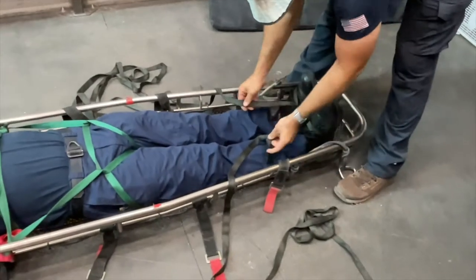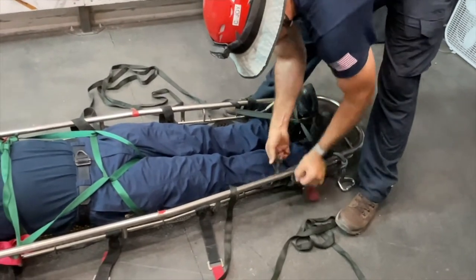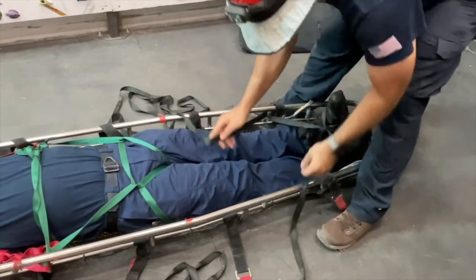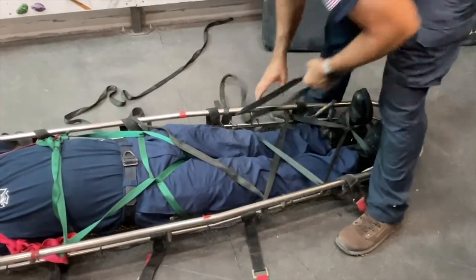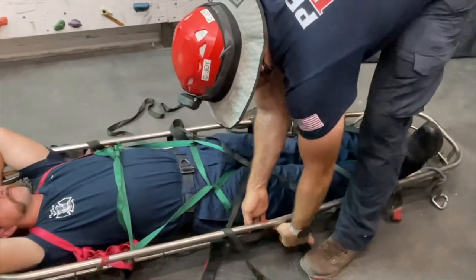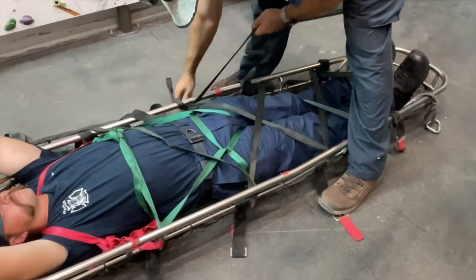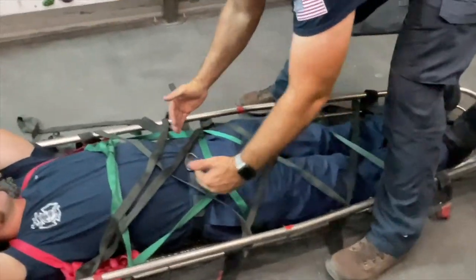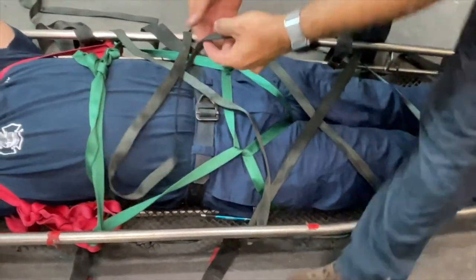You then want to catch the very first post above the feet. Remember to do full round turns with each post, and then you will continue to zigzag the webbing across the patient's legs. Remember to take slack as you go in order to secure the patient to the basket. Continue this until you are past the patient's waist. Again, depending on how tall your patient is — if the last post is above the patient's waist you can finish there; if it's below, come up to the next post and that will be the end.